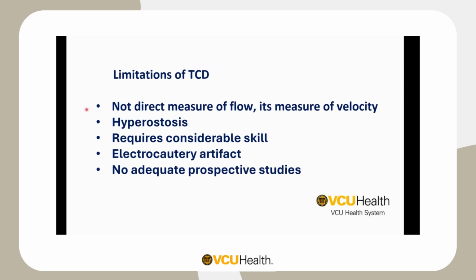Limitations of TCD: it is not a direct measure of flow, it measures flow velocity. We deal with hyperostosis. It requires considerable skill. We deal with artifact from electrocautery, and there are no adequate prospective studies. However, we are working on it. They should be coming out soon.